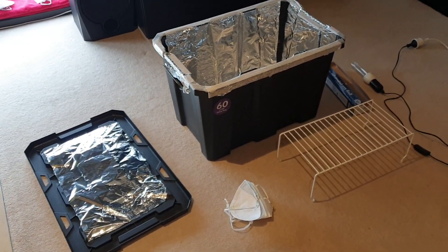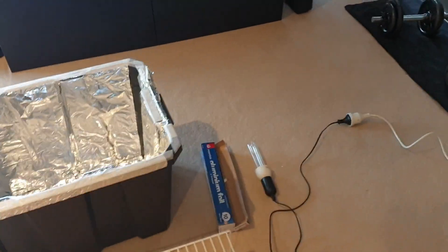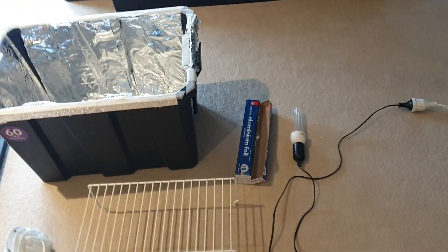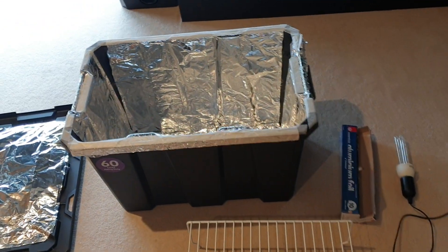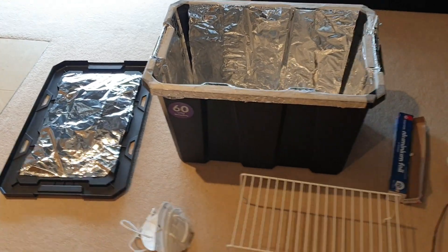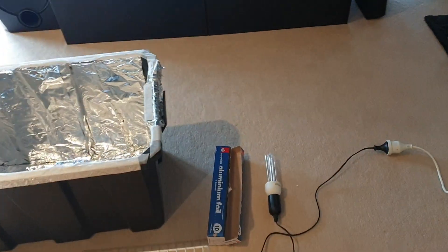Hey guys, Doughboy64 here. Sorry about the video quality — I don't normally make YouTube videos, I just want to get this information out there. What I made here is a UVC light box in order to sterilize and reuse some N95s, as per the study on the paper linked below.